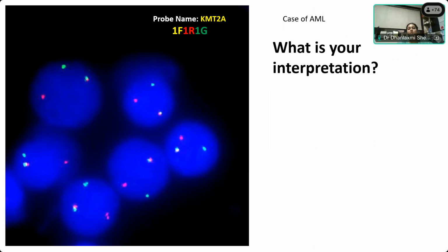Right. So what would be the result, or what would you conclude after looking at this? The KMT2A is also the new term for MLL, which is present on the 11q region.